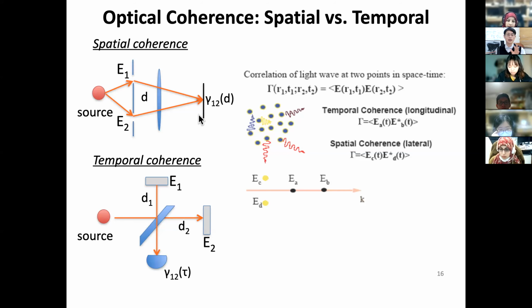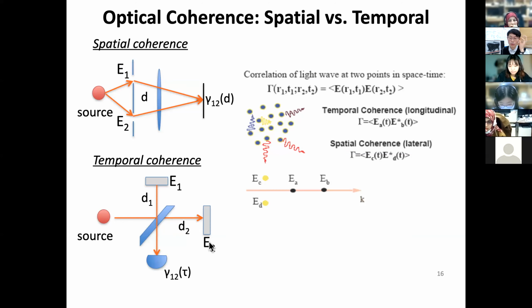Now you have to go back. I'll get back to this again, but remember the Michelson-Morley experiment, which won the Nobel Prize in physics, to disprove the presence of ether in the Earth as a medium for light movement. Here there's a source and a half mirror, which we call a beam splitter, and the beam splits into two. There's one mirror and another mirror, they reflect back and combine onto the detector. So we are interfering both E1 and E2 fields, and looking at the mutual interference.